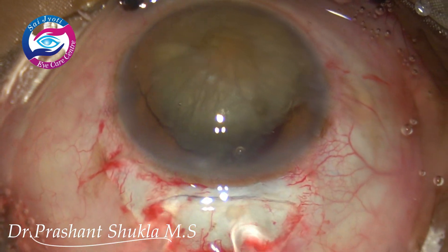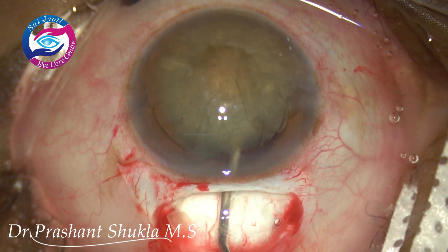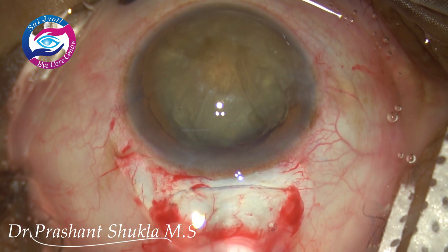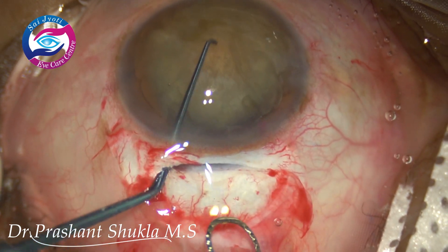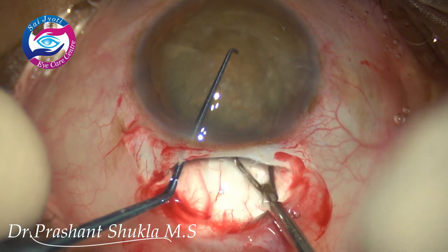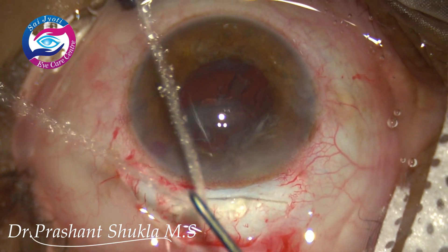The bimanual technique is a very good technique and even the largest nucleus can be wheeled out of the capsular bag with gross zonular weakness. Now employing the phaco sandwich technique, I am taking out the nucleus and the delivery was very smooth.